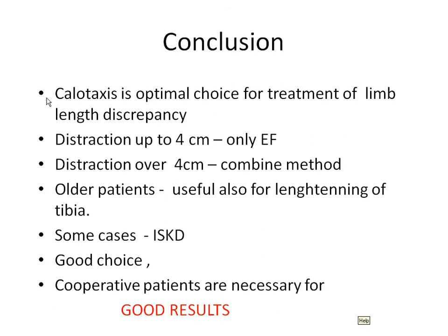We have some special patients after trauma of a long bone who have a locked nail and are healed with shortening. We have treated 4 patients in this way, which I think is quite nice. We unlock the nail, put on the external fixation, make an osteotomy, distract to the desired length, and then lock again. So patients are satisfied that they don't need any other surgery. It's necessary for a good result, a good choice, and a very cooperative patient.